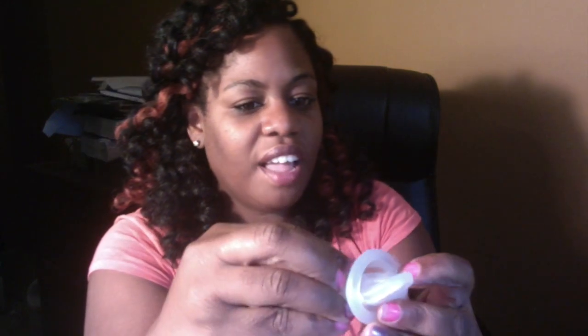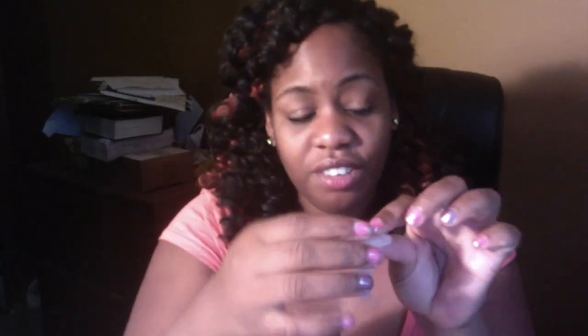So, see if I could get a better angle. All right, the best way is you roll this part out and you start to expose there is an inner tube in this condom. You just expose it out, still trying to keep your specimen straight up until you get everything completely out of the condom and your specimen is basically in there. So this is the condom part, and this is the actual cup that holds the specimen. All right. So you have your specimen here. And now it's this part.